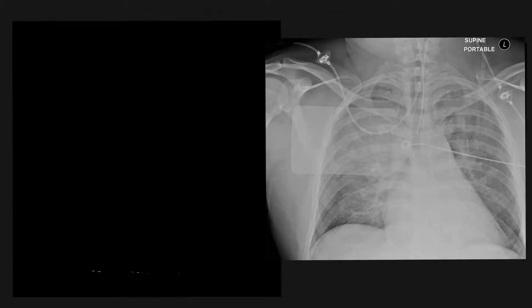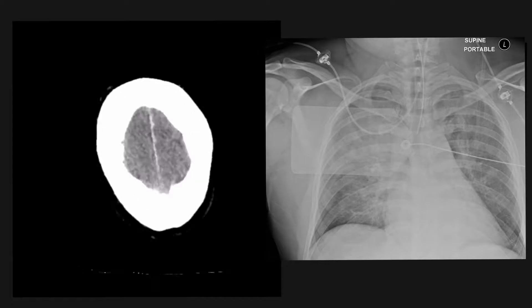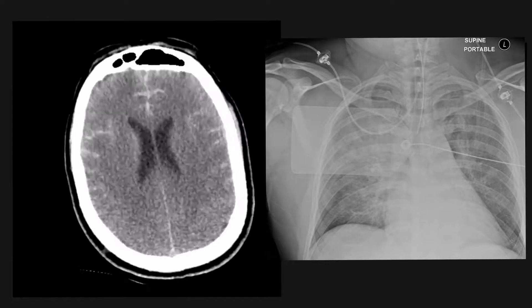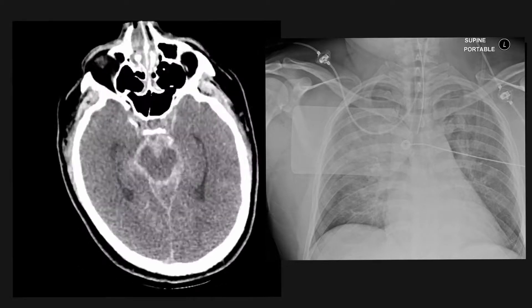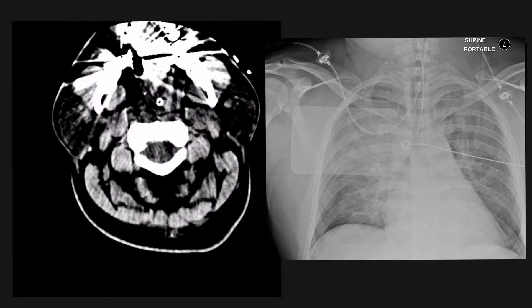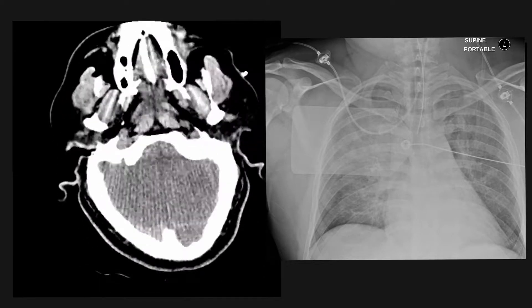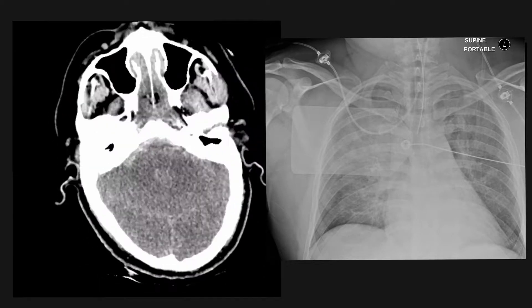This is another patient who has had an acute subarachnoid haemorrhage, and their chest X-ray shows diffuse reticular nodular densities in both lungs. This is in keeping with neurogenic pulmonary edema.